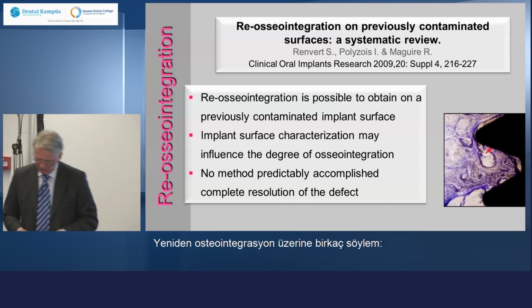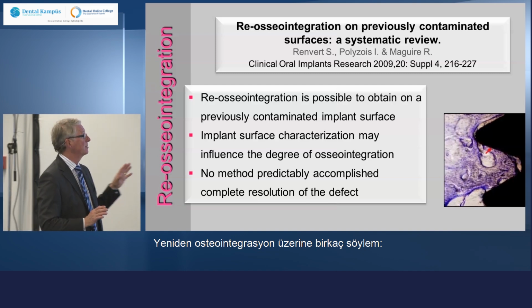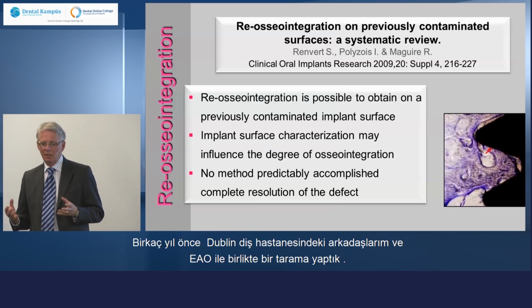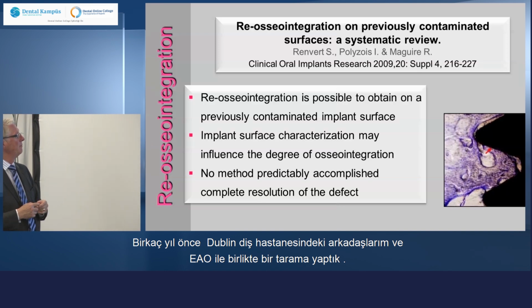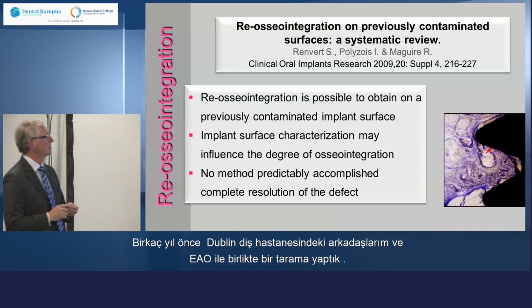Just let me mention a little bit about reosseointegration, because the question is, of course, is this possible? Can we really get reosseointegration? A couple of years ago, together with the EAO, and my colleagues at Dublin Dental Hospital, we did a review.